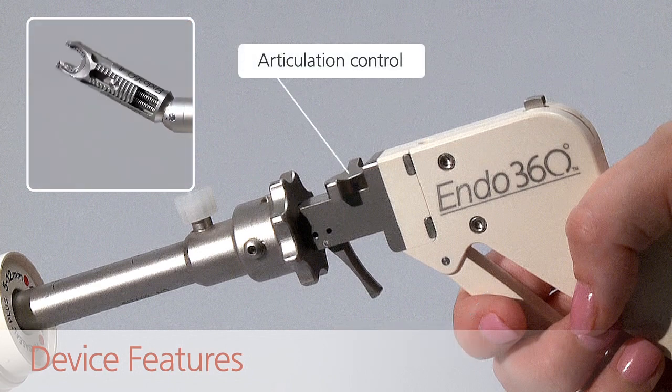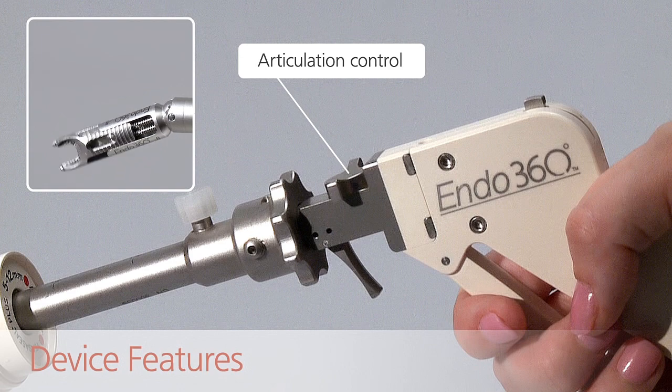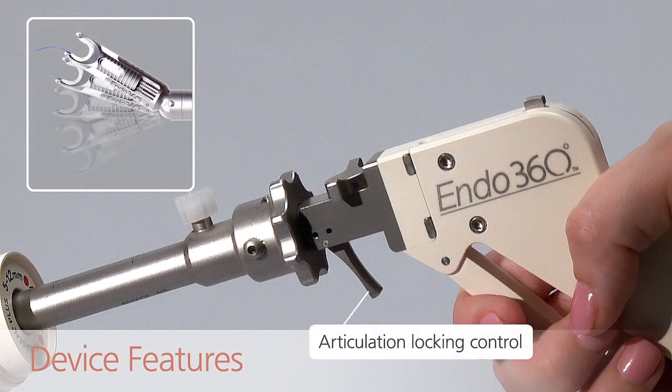The articulation control moves the suturing tip 60 degrees from side to side. The articulation locking control locks the suturing tip in place at the desired angle.